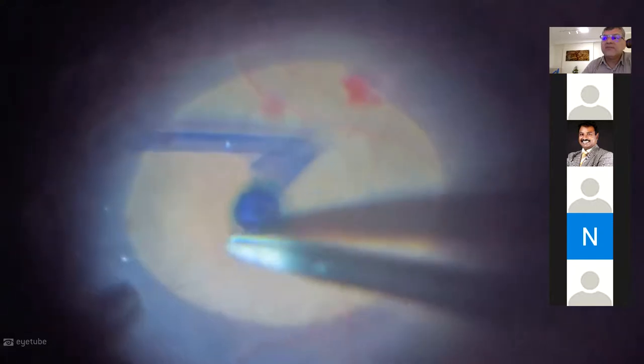I'm moving the ILM into the hole. You see the tubular fashion of the ILM — that's the way it remained after I peeled it off, but it could be open. You could do the same movement very carefully. Because this was a large, long-standing macular hole, we decided to do this technique. I put the ILM on the hole and with the tip — very careful not to damage the RPE below — I inserted the ILM in a very slow and gentle fashion, going downstream from nasal to temporal towards the hole.